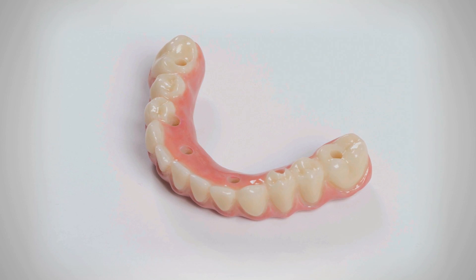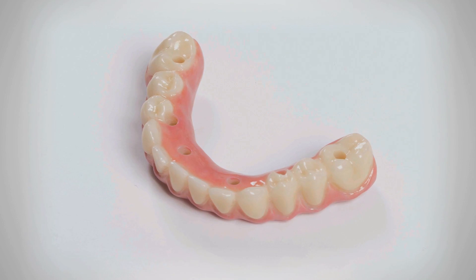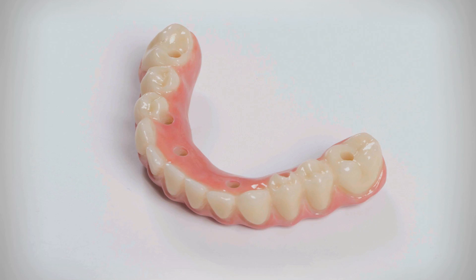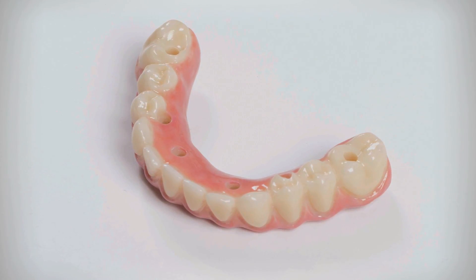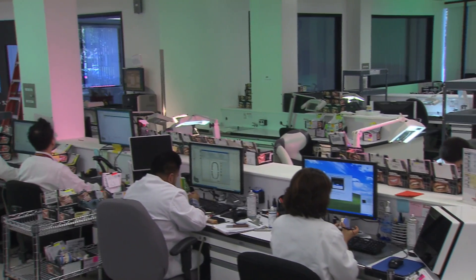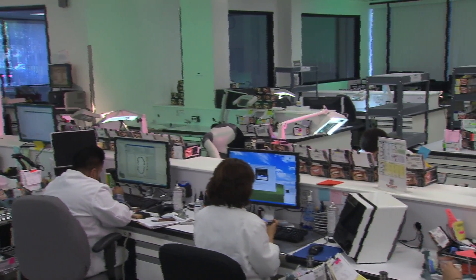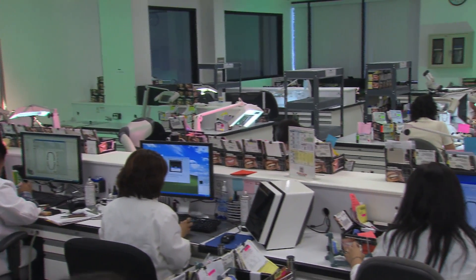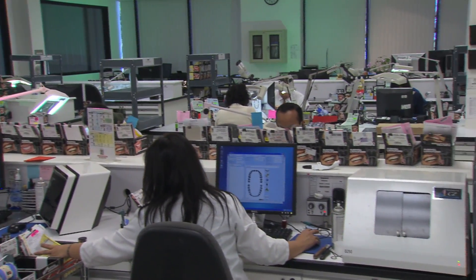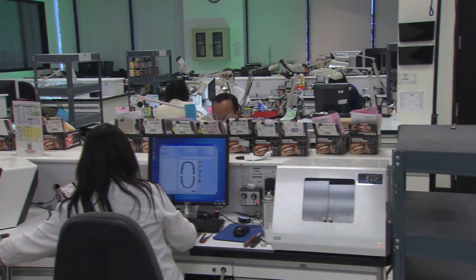After completion of the trial period and patient approval of the restorative design, the Bruxer Full-Arch Implant Prosthesis is ready for fabrication. If any significant adjustments are required, the provisional implant prosthesis is returned to the lab so a new series of scans can be taken and the definitive design can be updated, ensuring a precise and accurate fit of the final restoration.